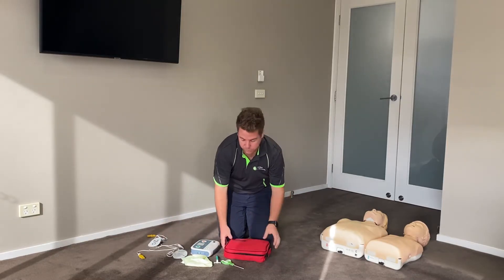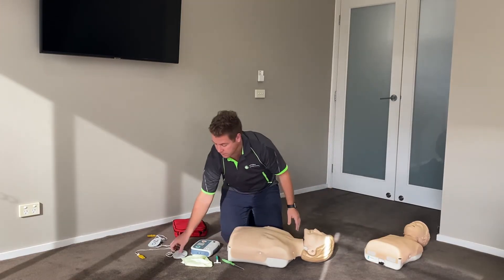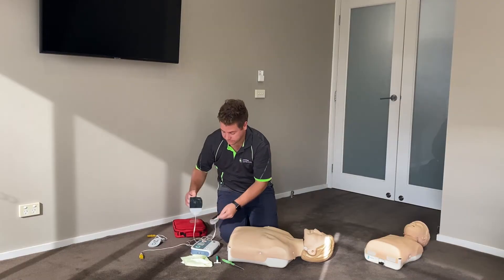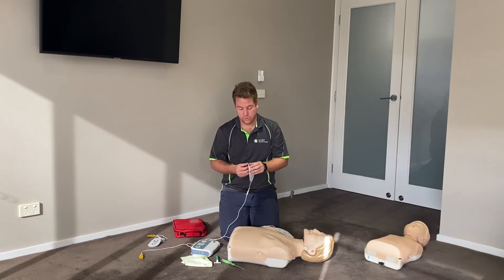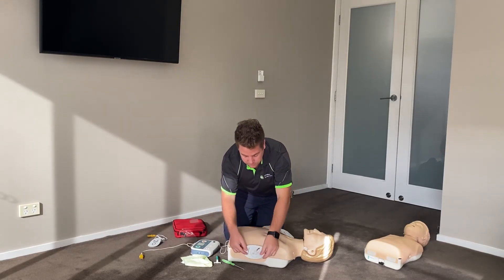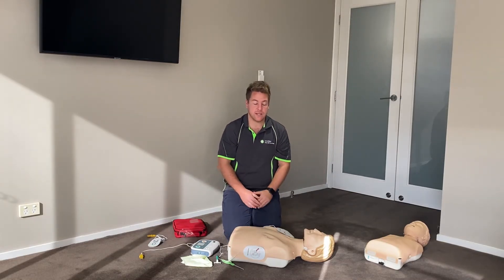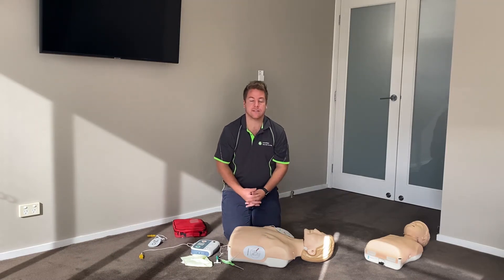The position to place adult pads on an adult: the first pad will go on the right chest, and the second pad will go underneath the left armpit. The reason we do this is because electricity will travel from one pad to the other, which automatically crosses the heart to deliver the shock.